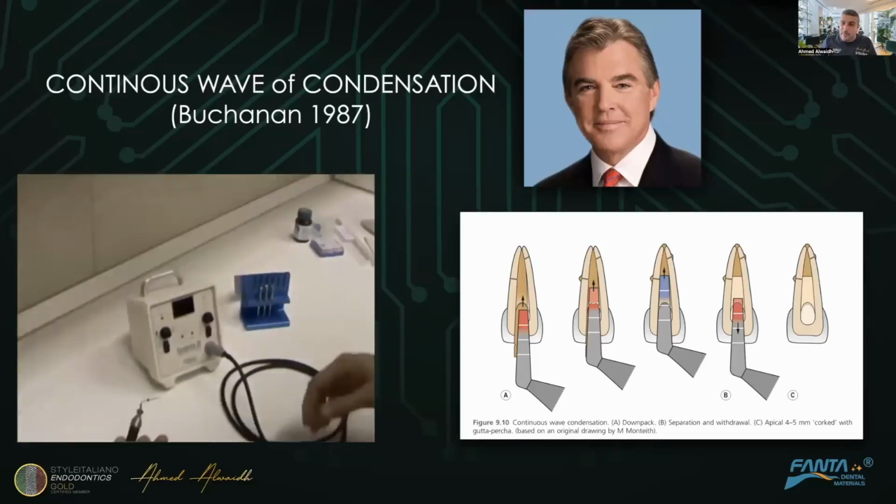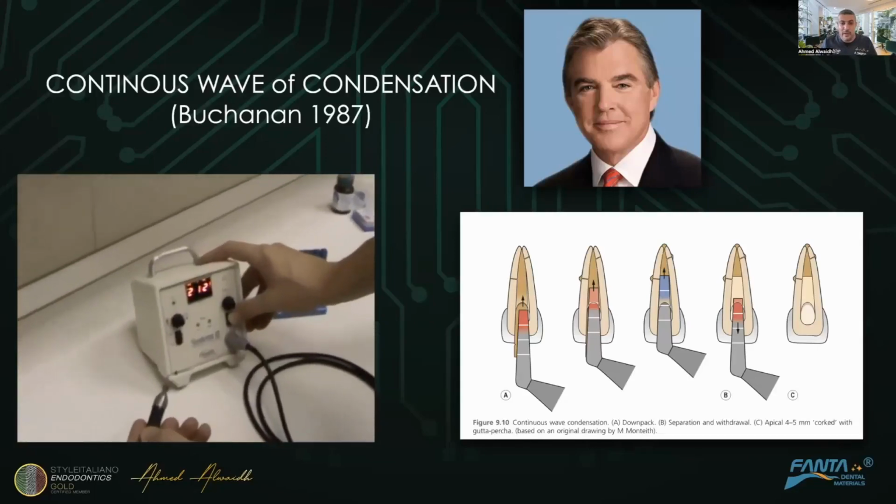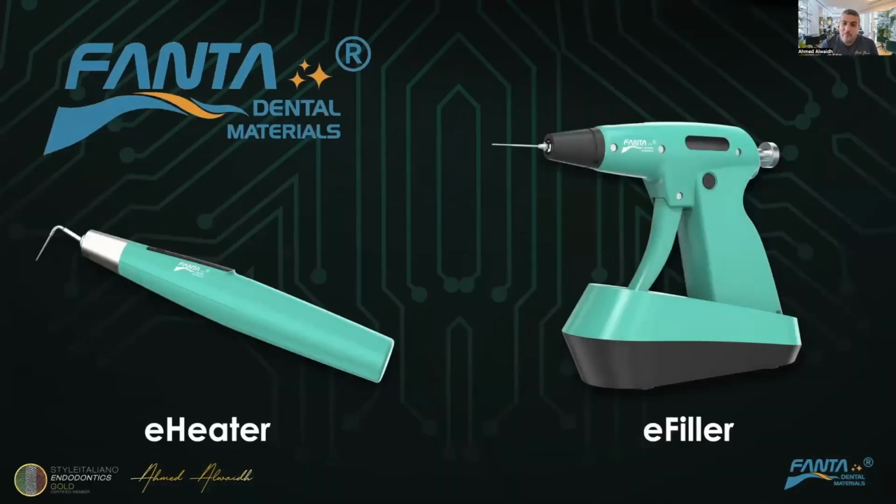Many brands and companies have introduced their systems, and one of them is Fanta, which introduced a very nice obturation system that consists of two devices.